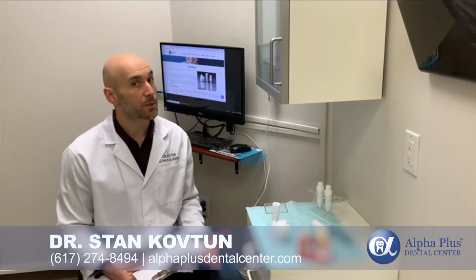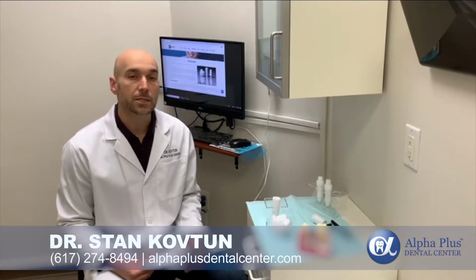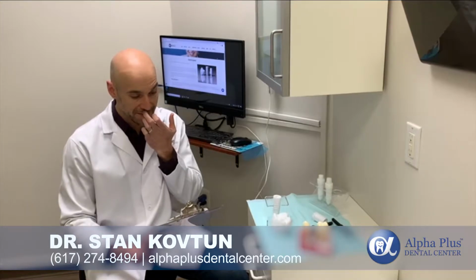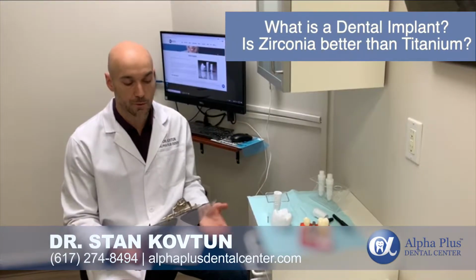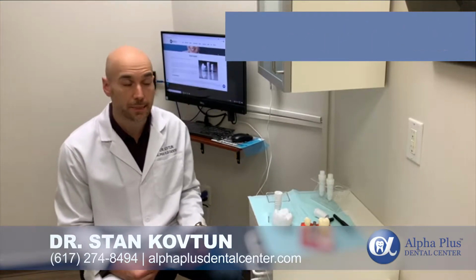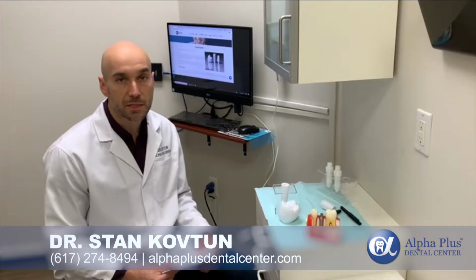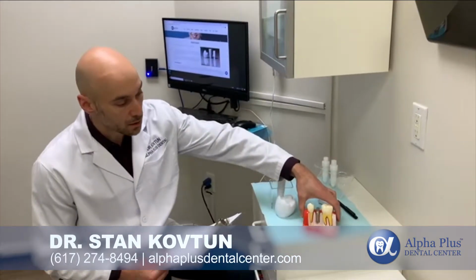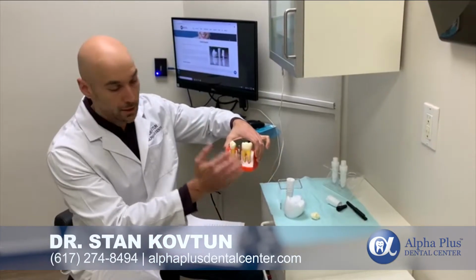And we've been receiving lots of emails with questions, asking us, they've noticed on our website that we are doing zirconia implants. And so one of the questions was, what is a dental implant? And, is zirconia better than titanium? So a dental implant is essentially a replacement for a missing tooth. So if we take a look at this model here, this patient is missing the tooth in the middle here.